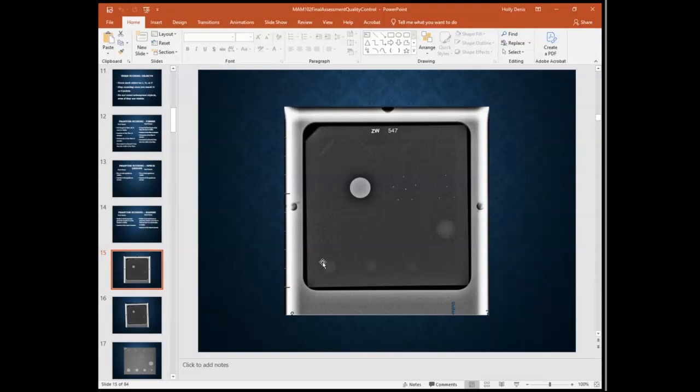This looks like a complete circle to me, so it's going to get a full point. Same with this. I may see a little tiny bit of a break right here where it's a little fainter on the kind of top left-ish, but the border is generally circular, and it's more than 3/4 in on my monitor. So I'm going to count that as a full one.